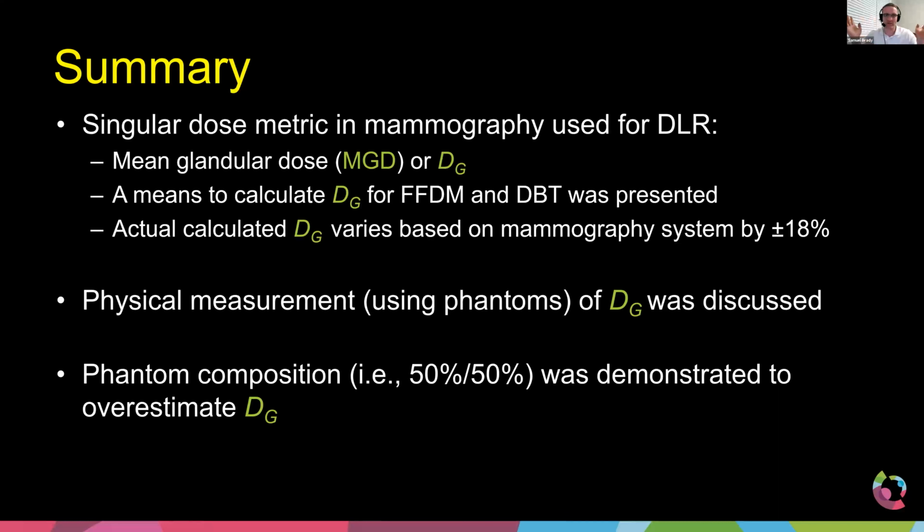If you don't have a medical physicist and you don't want to think about it, you just look at, okay, if I'm all the way over here, maybe I reduce my dose a little, look at my image quality, it's okay. Reduce my dose a little, look at my image quality, it's okay. Reduce my dose a little, and I'm starting to not like it. So maybe I back it up a little and I stop there. Now the question is, okay, what does that 18% mean?